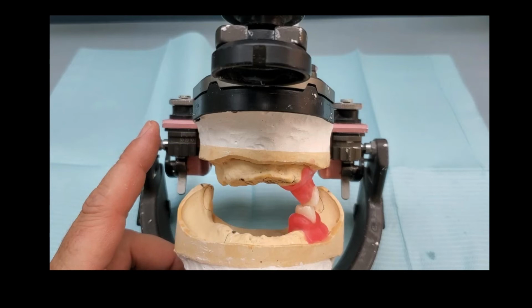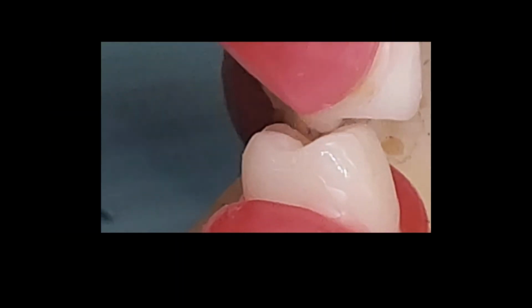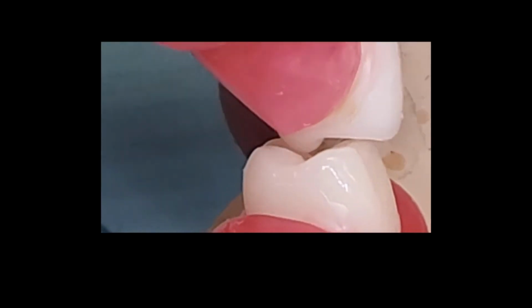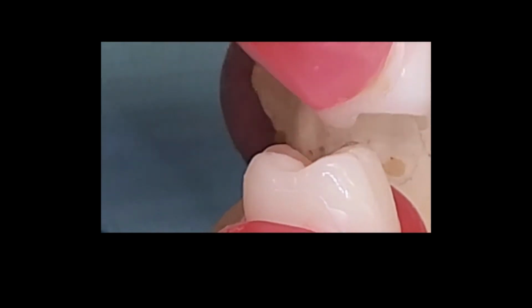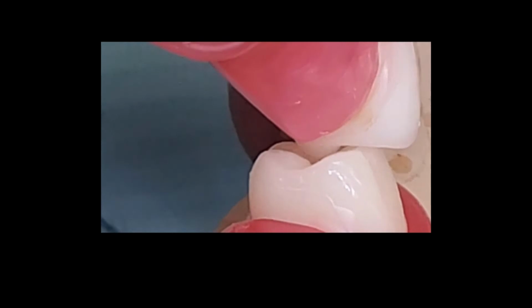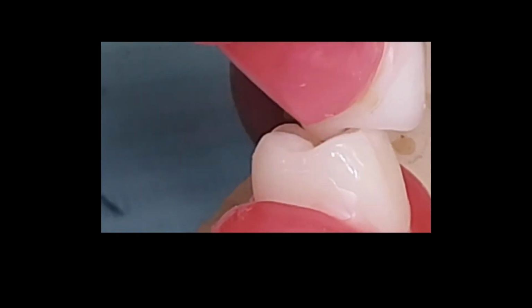So again, this is a Protar articulator. I've done it on every articulator, hinge articulators, it doesn't matter. You can move an articulator and facilitate a chew cycle. And this is what it looks like up close now, is the cusp coming in, and I'm just trying to control the hit and slide. Depending on how I move the articulator, you can see sometimes there's no hit and slide, sometimes there can be a little bit of one, and that's what I would go in and adjust. So that's just what it looks like up close.